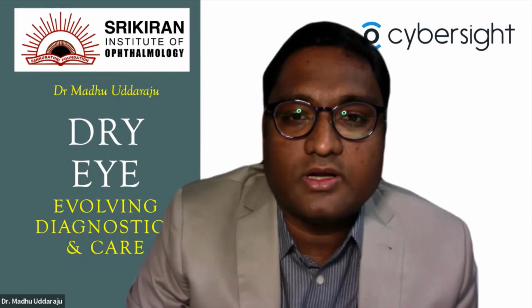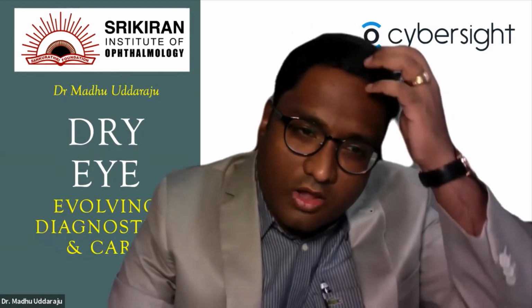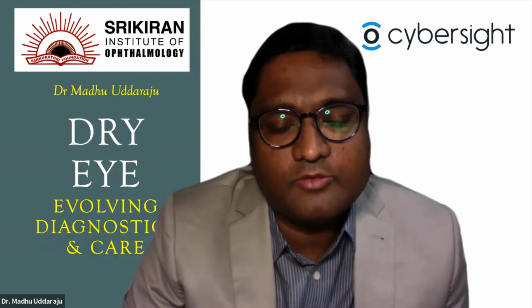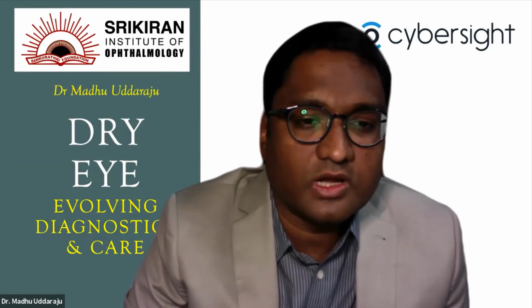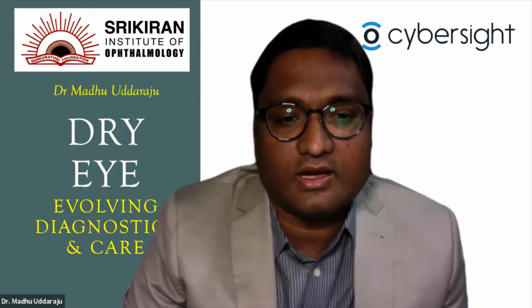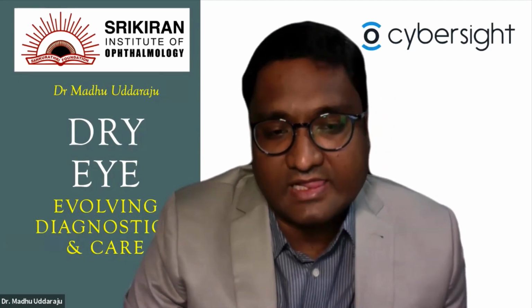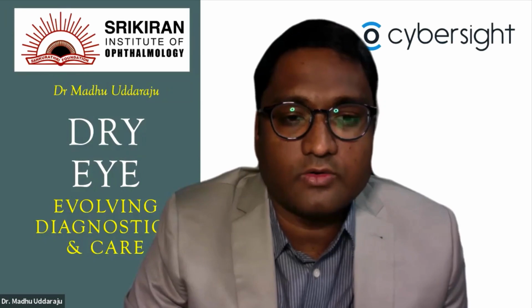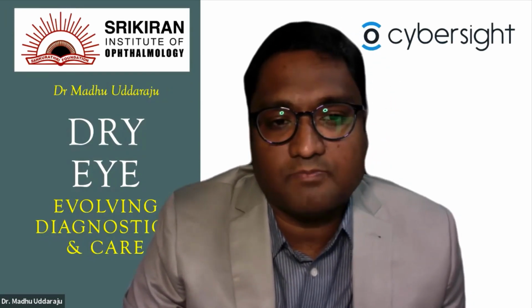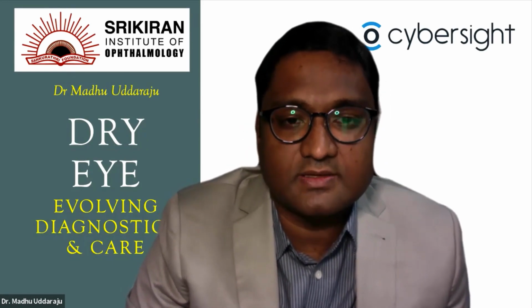What is the antibiotic, and when to go for LipiFlow? All these I have told you. LipiFlow and IPL treatments, we usually go for them before the patient is opting for a refractive outcome, especially a surgery, cataract surgery or multifocal surgery or a refractive LASIK. We want to make sure that the ocular surface is healthy prior and post to have a good refractive outcome. That is where we treat it aggressively. If the patient is not having much symptoms, that is when we don't go for these procedures.